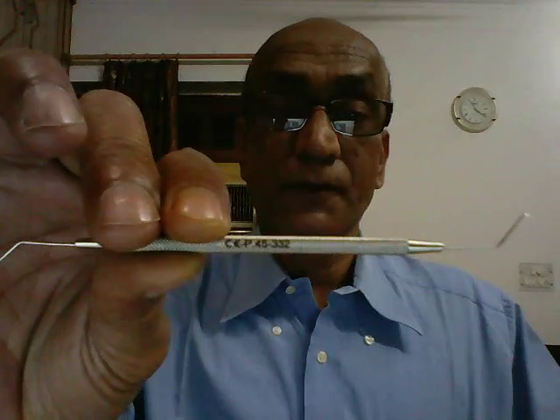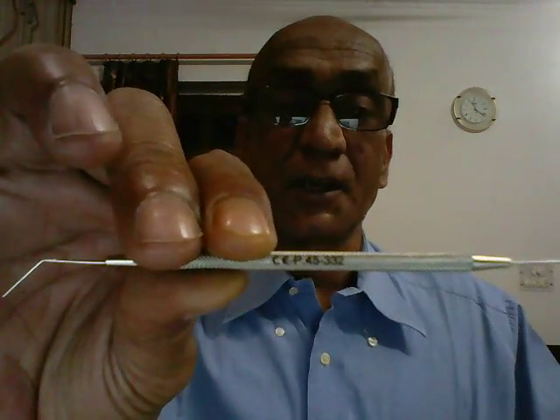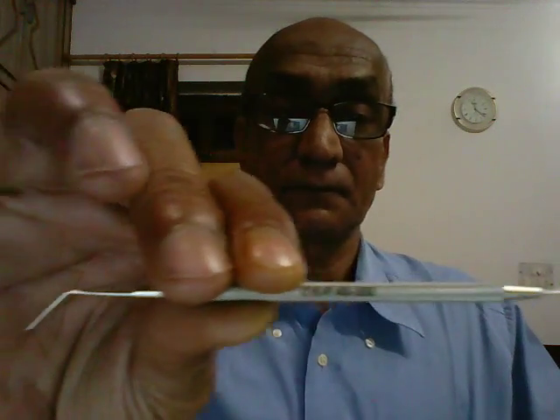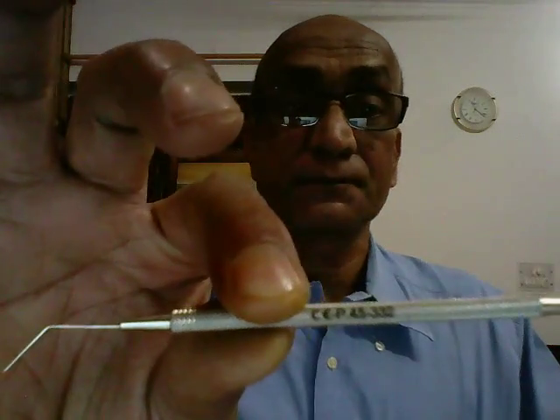The instrument that you see here in my hand is referred to as a FACO chopper and Szynski hook IOL dialer. The middle portion of the instrument is the stem, which I'm holding in my fingers. Let's take a look at each of the ends.